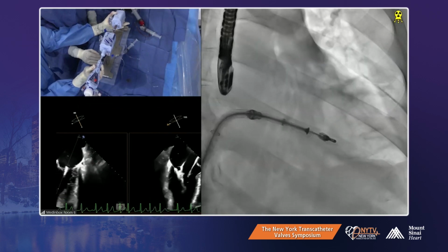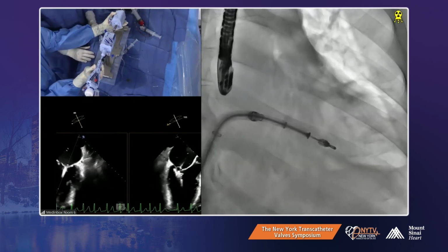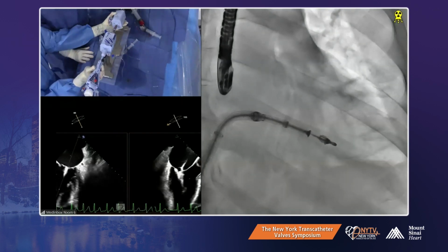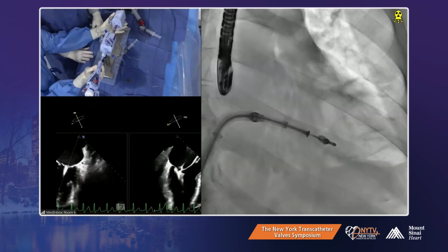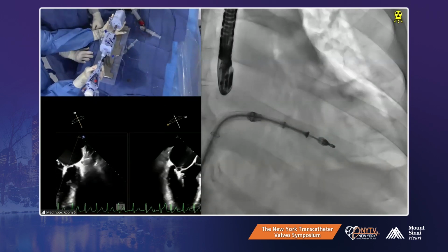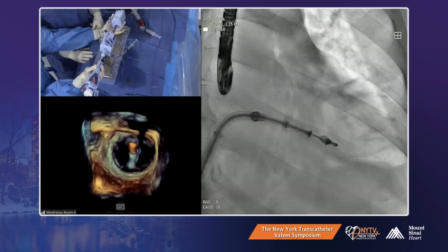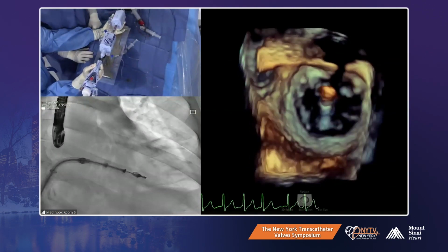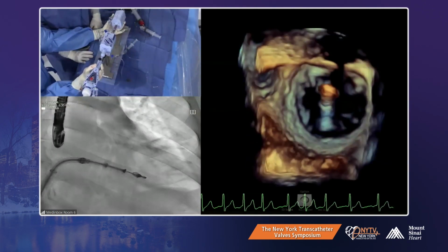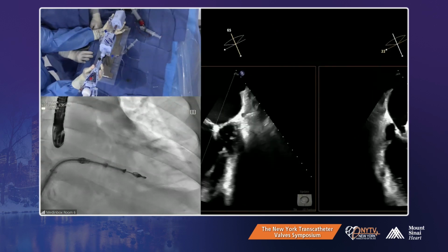It still looks like you're somewhat out of plane for the anterior. Let's go more lateral. Can you show us a 3D view just once more? Yeah, sure. Just a real quick 3D, Malcolm. We're lateral. A little bit more. Well, it's not bad. I mean, it may be, a little counter. Oh yeah, you might be able to go counterclockwise a little bit.